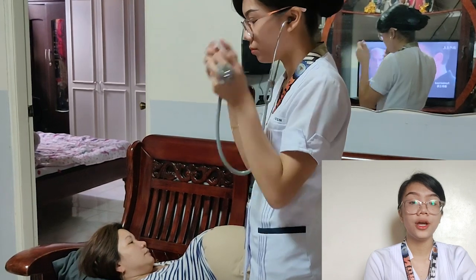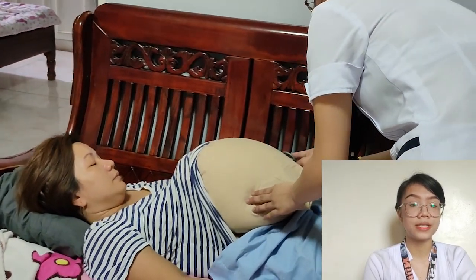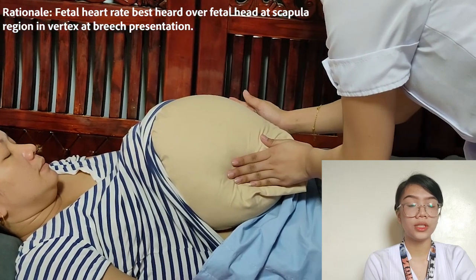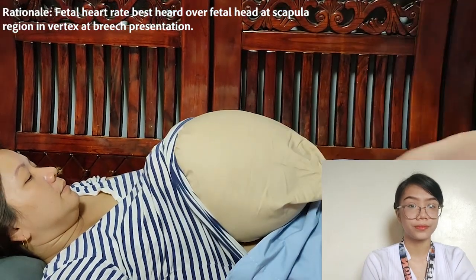Fetal heart rate auscultation. Place the bell side of the stethoscope chest piece on the fetus's convex portion, closest to the anterior uterine wall. Then listen, pressing in firmly yet gently. Count a full minute while holding the stethoscope chest piece, while the other hand feels for the client's radial pulse.